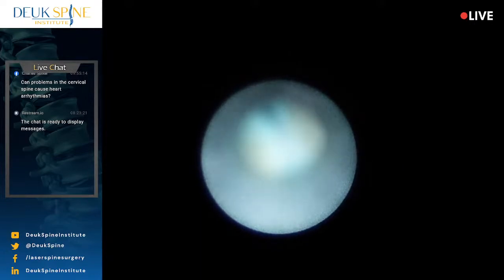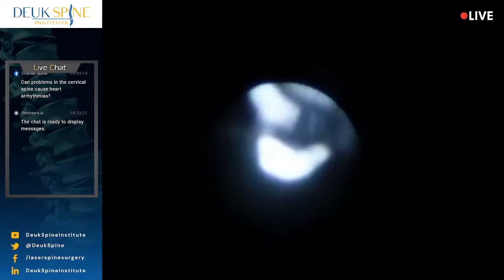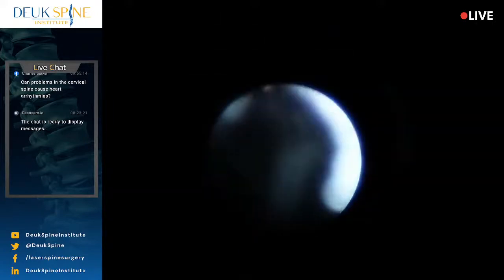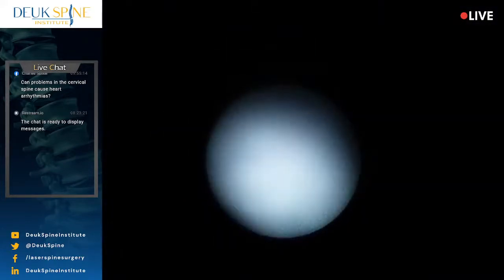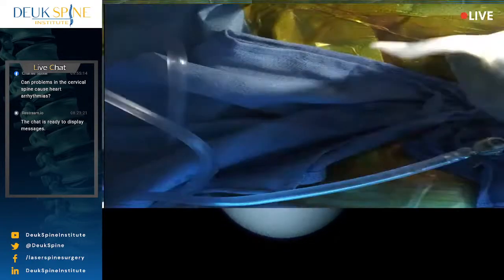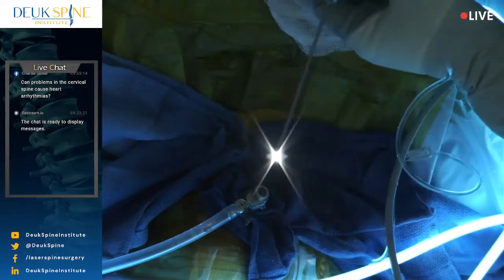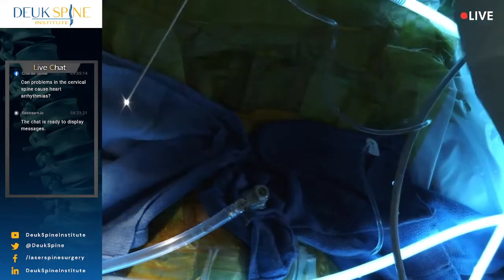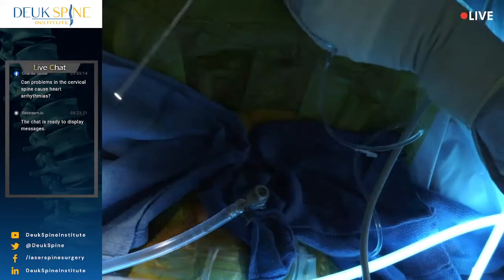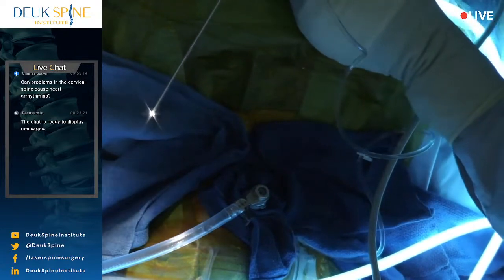All right, so what is that? Why do we lose our image? Something on the lens. It looks kind of blurry, right? So this is, I hope, not the fiber optics. I'm hoping it's the camera scope interface, but it may not be. And if it is, that may be a problem. We're going to need another cervical scope. Why don't you bring another cervical scope in the room? Thank you, in case we need it.